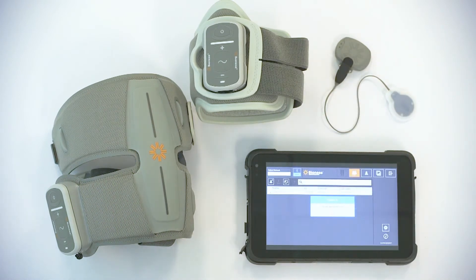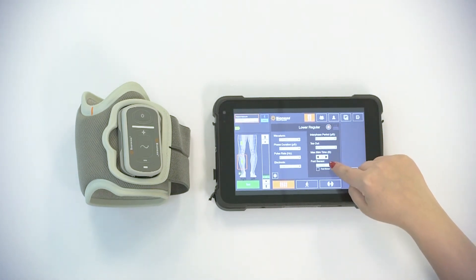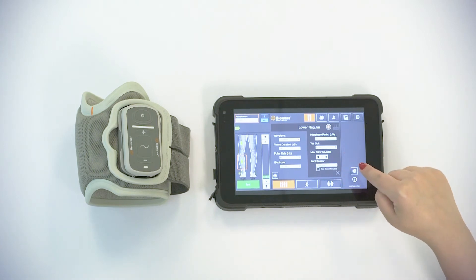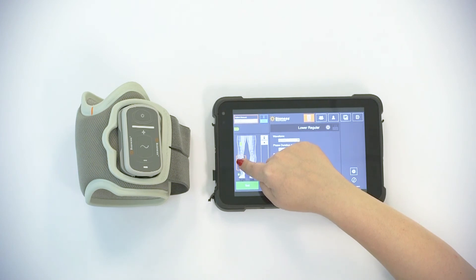Select the desired patient. Don the thigh cuff onto the patient's leg. Place the foot sensor in the desired shoe and choose the side on the programmer. Leave the lower cuff within range of the programmer. Please note it doesn't have to be on the patient's leg.